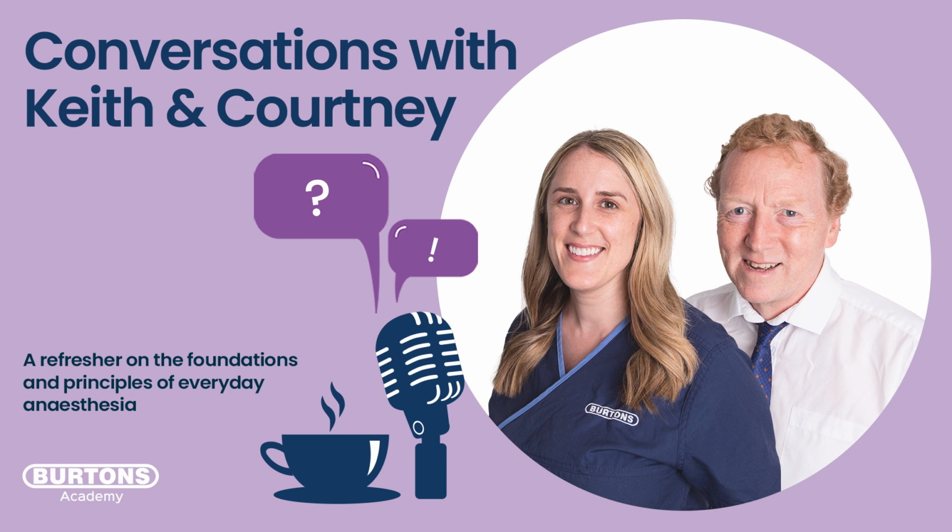But there are definitely some limitations with pulse oximetry. The thing I like about it is that under anesthesia it gives you a nice audible pulse. In that really big, nice STEP study on morbidity and mortality, using a pulse oximeter gave a reduction in risk for our patients, because we can hear a pulse. But using it under anesthesia versus in the pre-op or post-op phase is where I have more trust in it. When should we trust the pulse ox machine? I know this isn't going to be a pulse ox podcast, but when should we actually trust it?